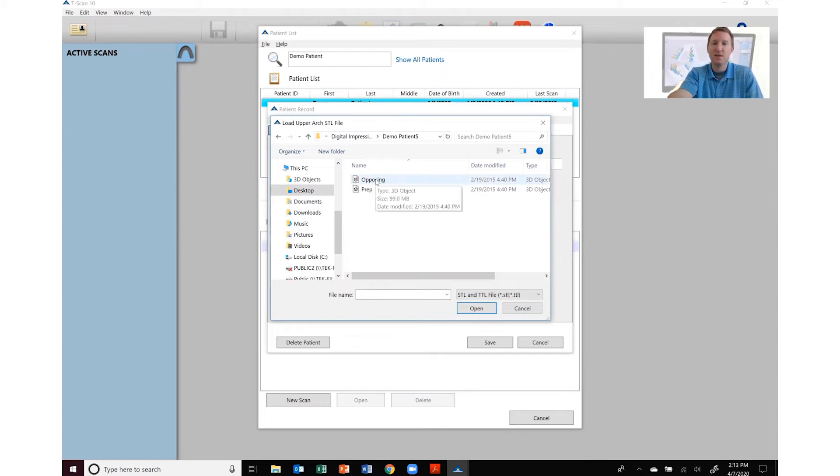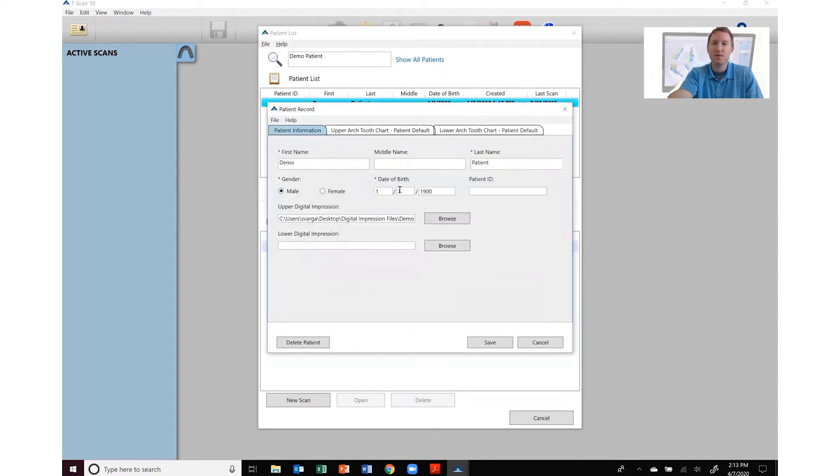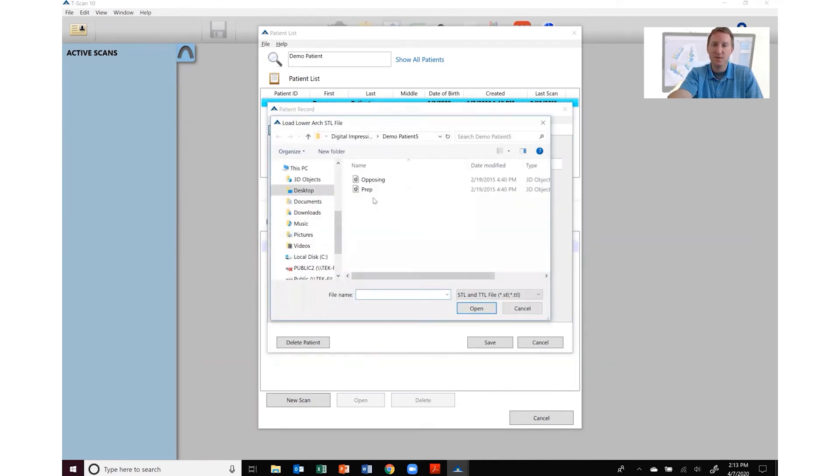If I click on opposing then I'm going to do the same thing for lower digital impression. In this case I'm going to click on prep.